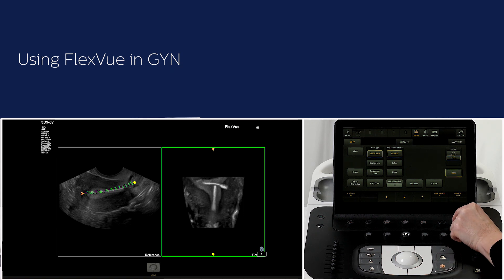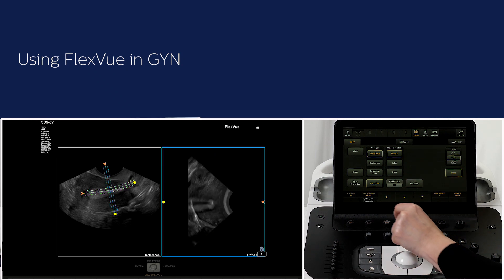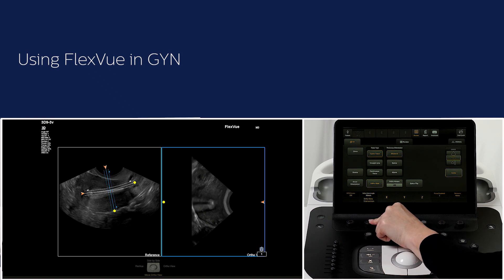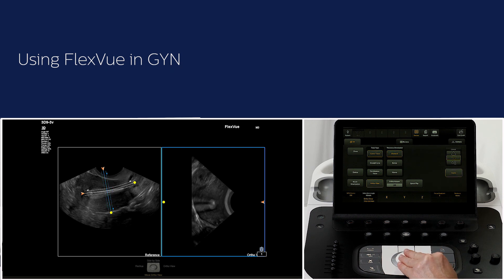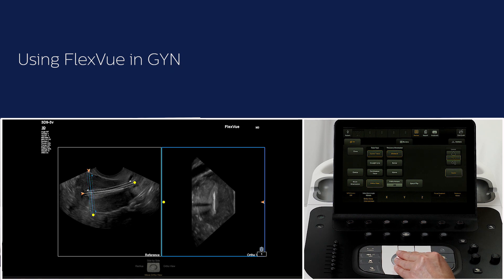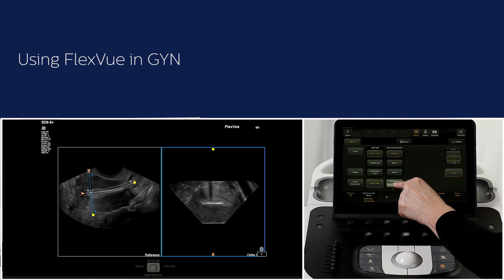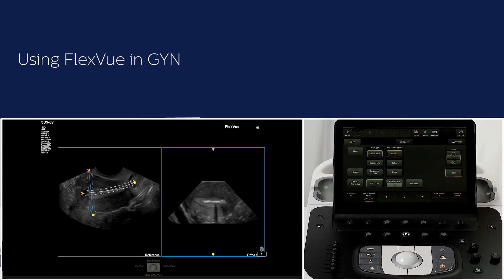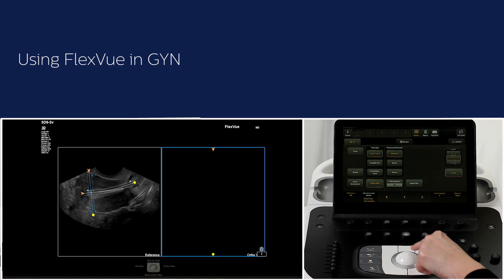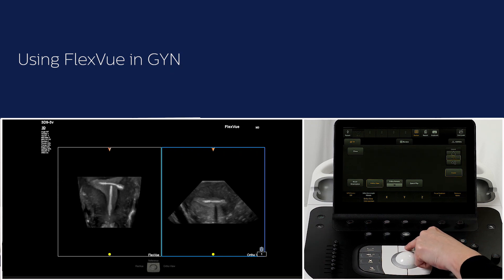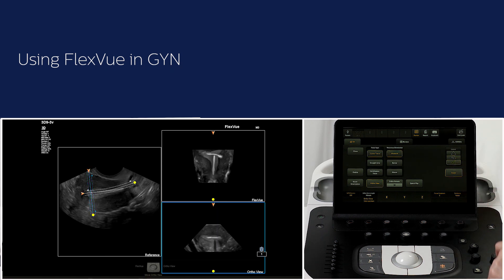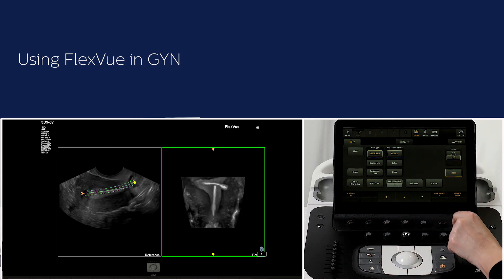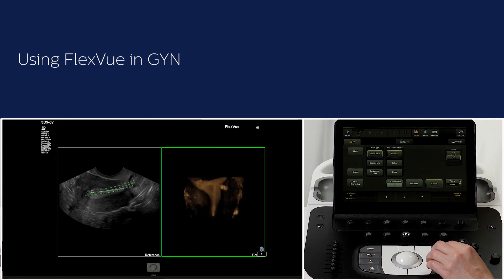Change the thickness and/or tissue emphasis if needed. Activate ortho view and adjust the intersection to see the FlexView and ortho view image side by side, or select a three up. Deselect ortho view and press volume, then choose the desired vision.